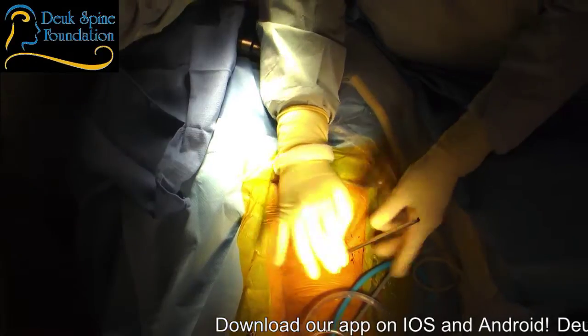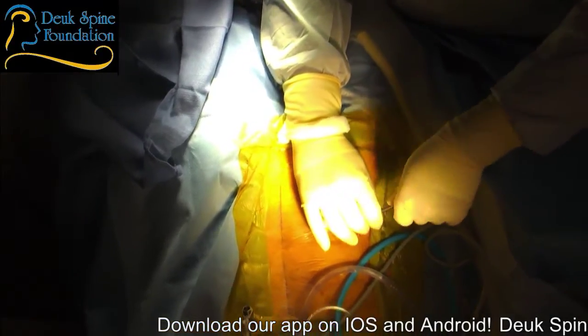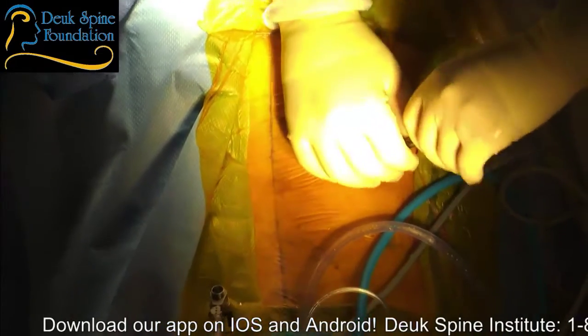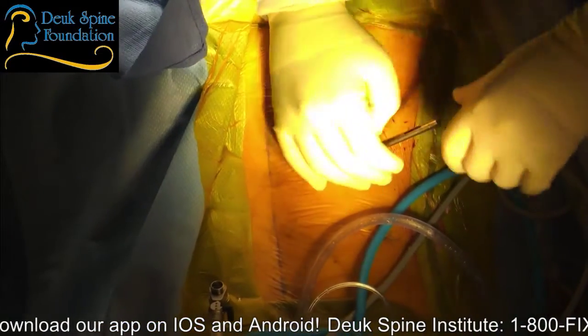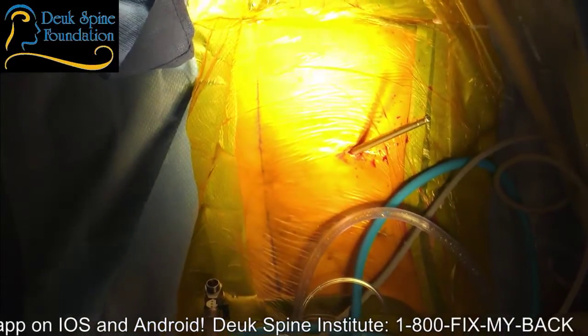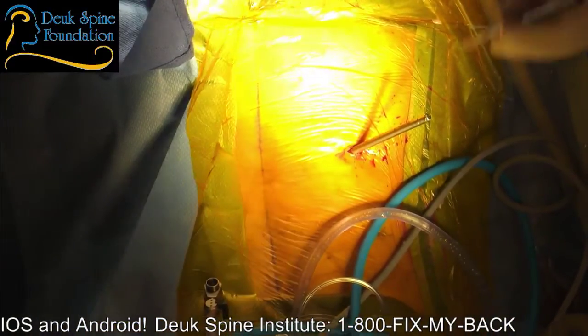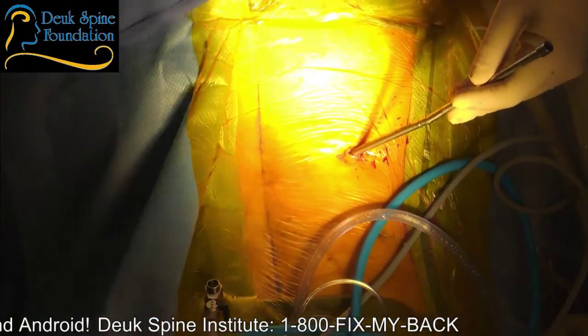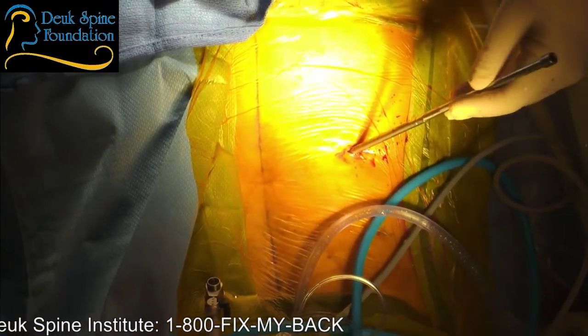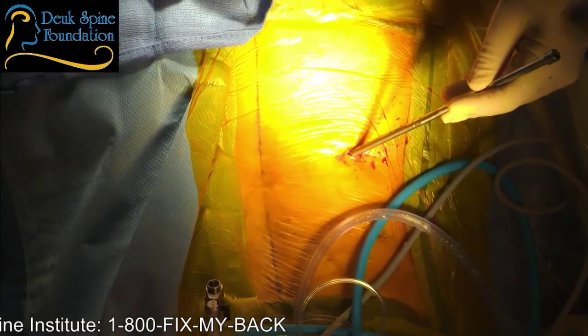And this is spinal endoscopic surgery. This is the most advanced spine surgery in the world done today. Obviously for degenerated discs, herniated discs. I'm not talking about tumor surgeries. I'm not talking about reconstructive surgeries. I'm talking about herniated discs, which is the vast majority of people's problems that have spine problems. They have herniated discs.